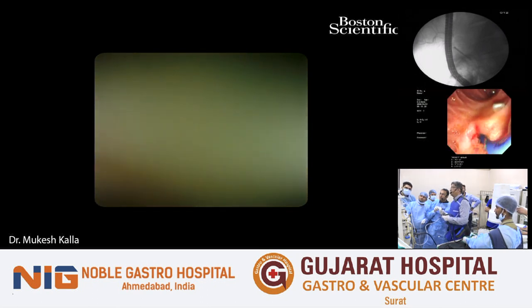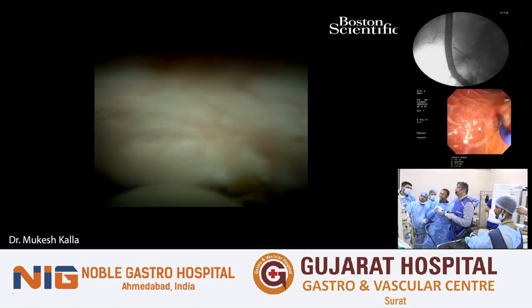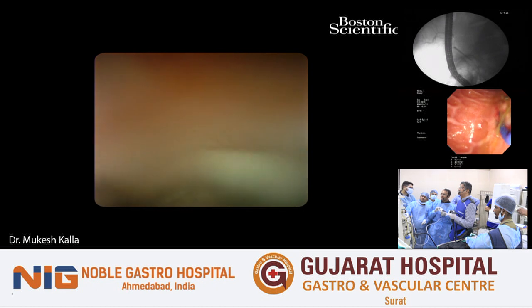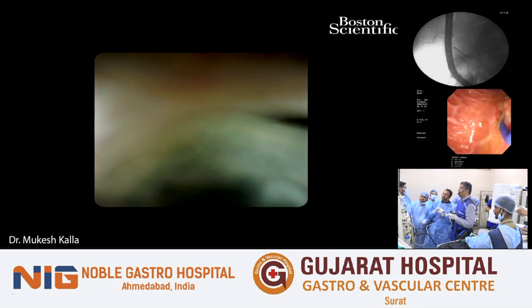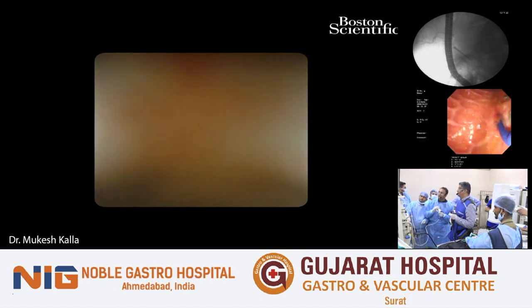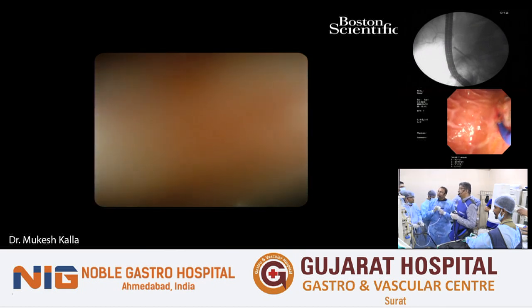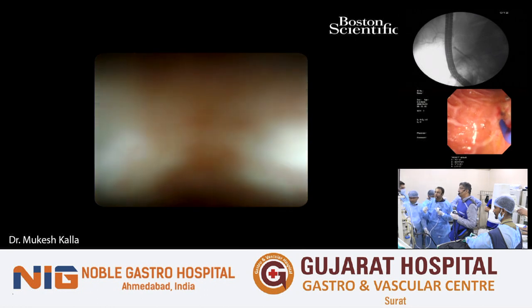So the whole game is in the hand of Somil right now. I think there is a small stone, is it? Yes. Or just a bubble? No, this is stones. You see this? Yes, you can take the basket. Spy basket, yes. Give me. Take a spy basket. We'll try and get it out.